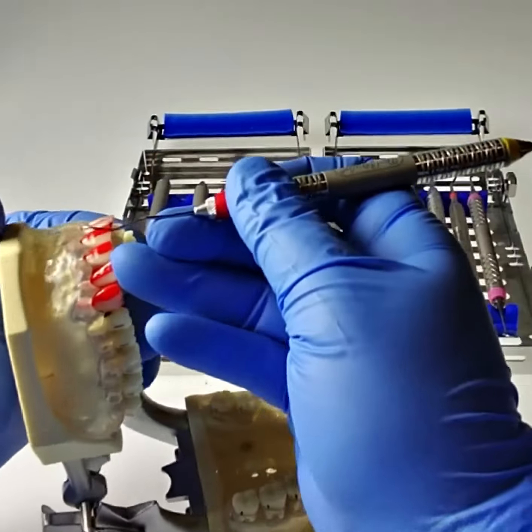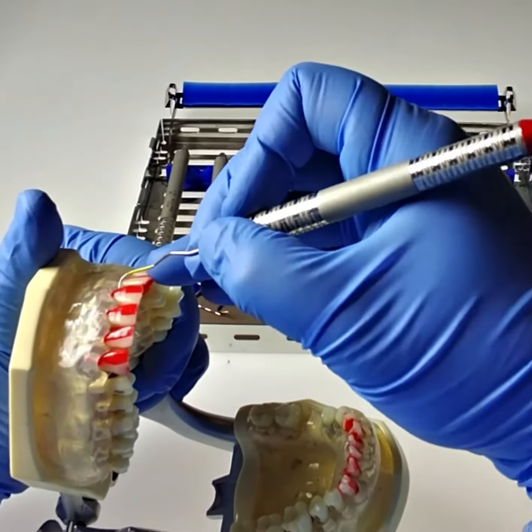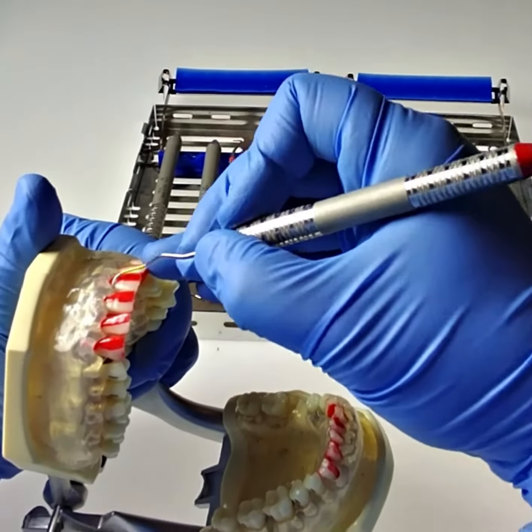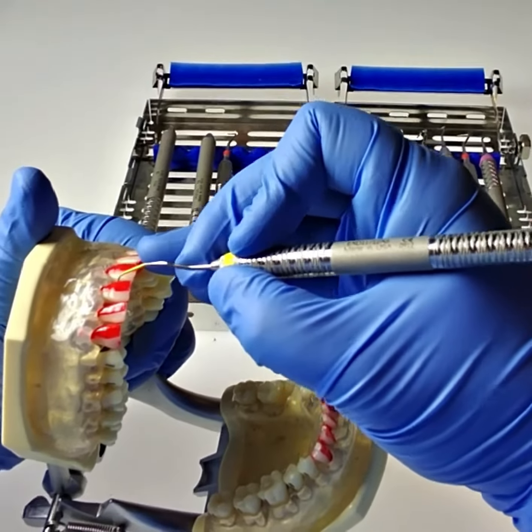To do surfaces toward you for a right-handed clinician, go to nine o'clock, flip the instrument to use the other working end, start at the midline, overlap the midline, and rock and roll into the interproximal.